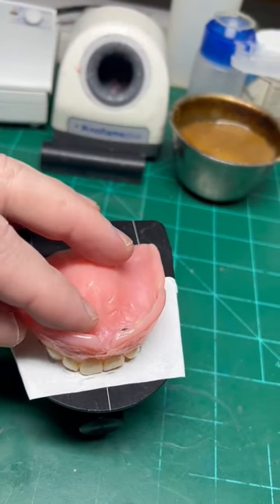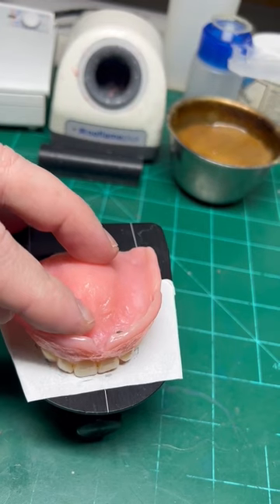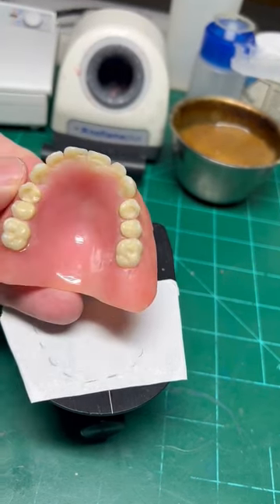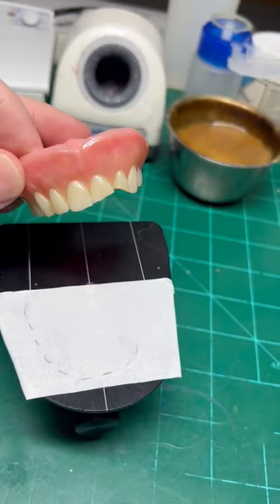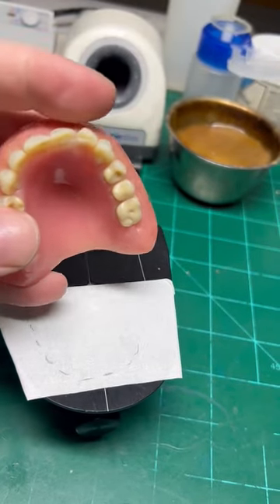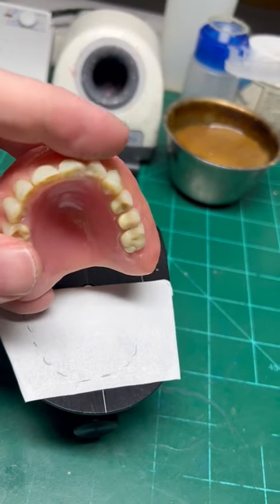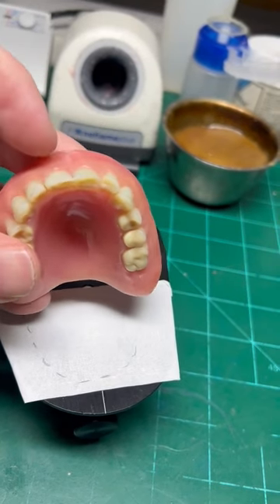So what I try to do is I actually try to make markings on the table so when I'm setting the replacement teeth, I'll be able to line them up with those markings. Additionally, I'm going to make a slight putty matrix just to give me an idea of what the facials of these teeth will need to be positioned like.